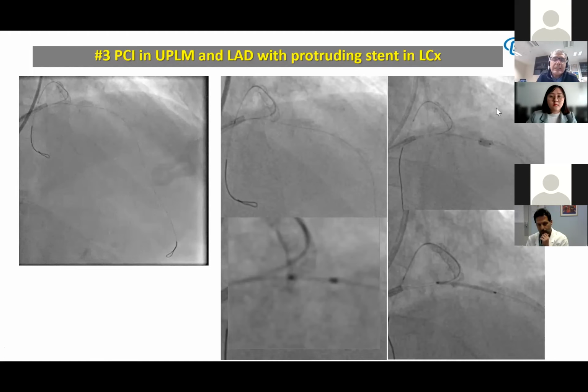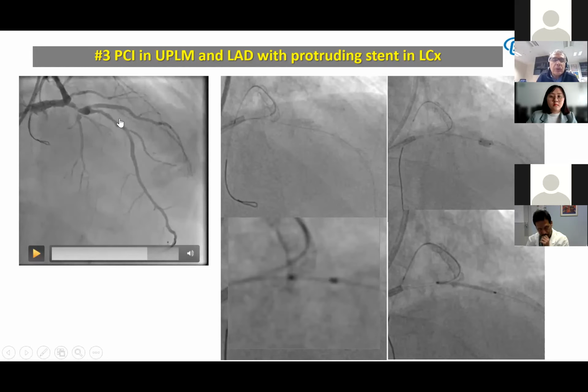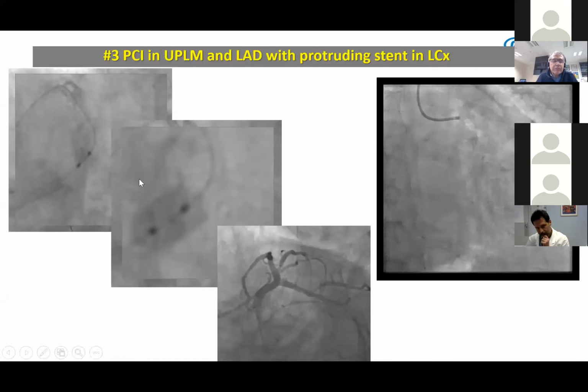In this case, it's useful because we have an ectasia, and I perform a 3.2 here, and then decide to use a 3.5, and then after we put another stent across the stent in the left main, left main to LAD, we prepare with 4.2, then post-dilate with a 4.2 POT balloon, and then post-dilate the left main, proximal to the carina, with the 4.5 by 6 millimeter in length POT balloon.